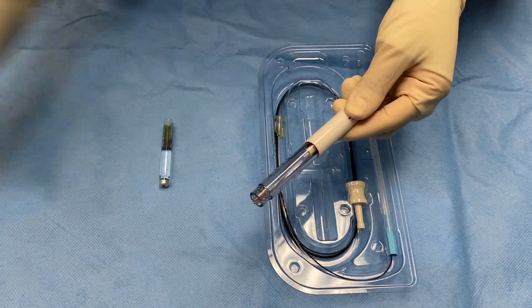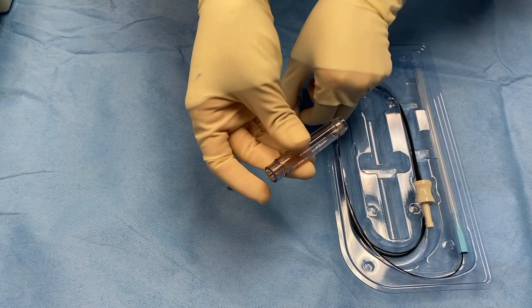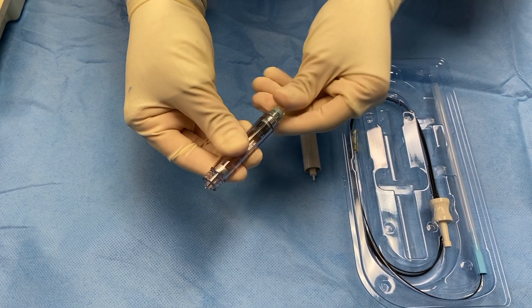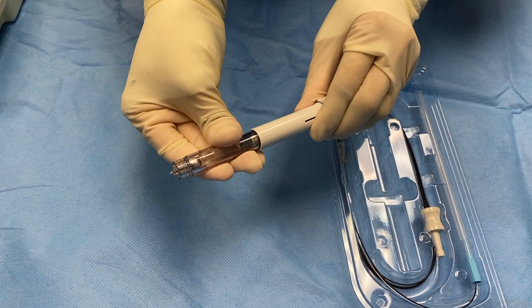Place the viscoelastic ampoule seal side first into the viscoinjector and push until it is punctured by the internal spike. Reassemble the viscoinjector and advance until viscoelastic progresses from the tip.